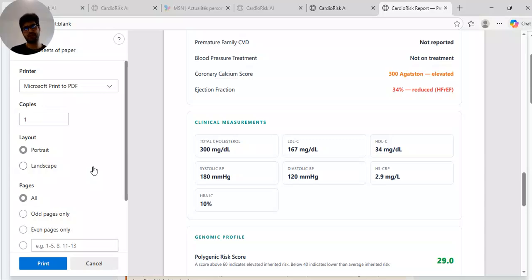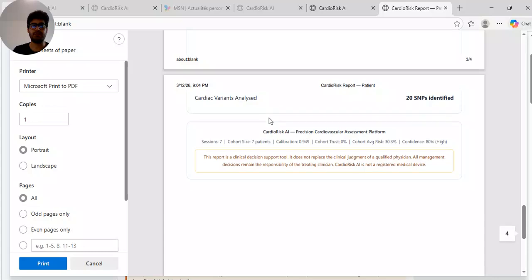the same VCF which you have gotten from any company. I must say any company. It has the capacity to upload the VCF from any array, any real-time platform, any research point of view, using whole genome or whole exome, depending upon whatever kind of platform you have used to make the PRS or the VCF. It accepts everything, and you have a full profile score.